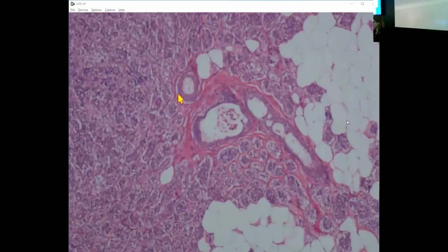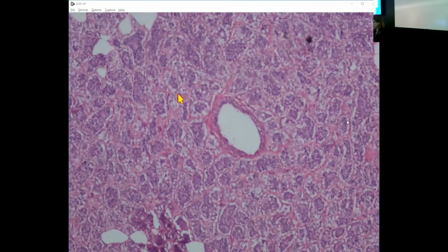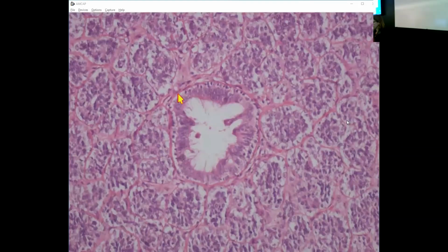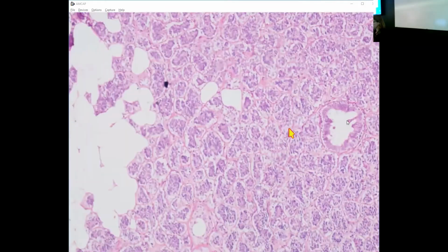Nobody? So that's small glandular structures which are clearing around. Yeah. So what's striking is this clearing of the cytoplasm. So it seems biphasic. Yeah, I would say it does look biphasic, right? So it looks like there's this layer of cells with clear cytoplasm, and then a layer of what we might say is a luminal layer of cells that have more eosinophilic cytoplasm. But they do seem to be small glandular structures otherwise.